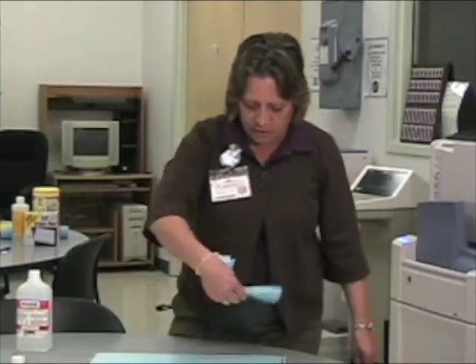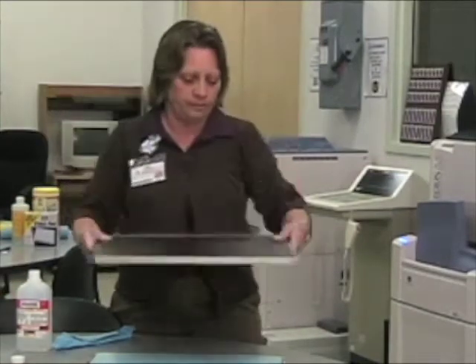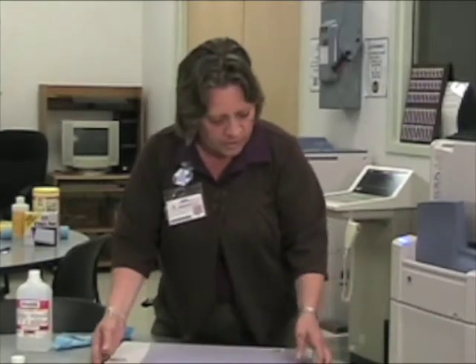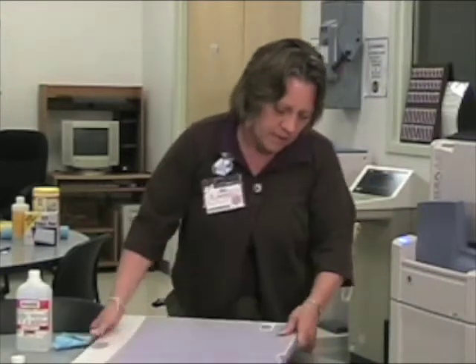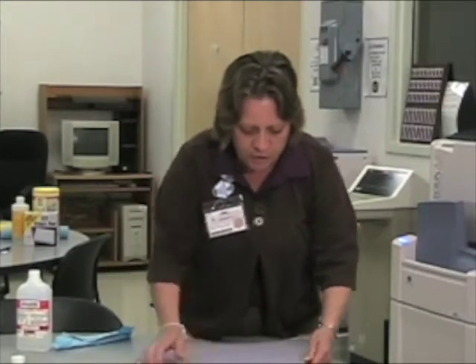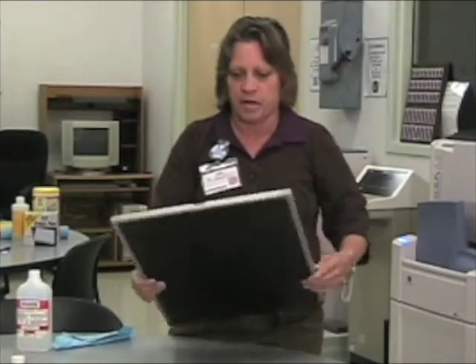Give it just a second to evaporate, then take the cover and put it back on. Hold the latch down until it latches tight and make sure that it's latched tight.